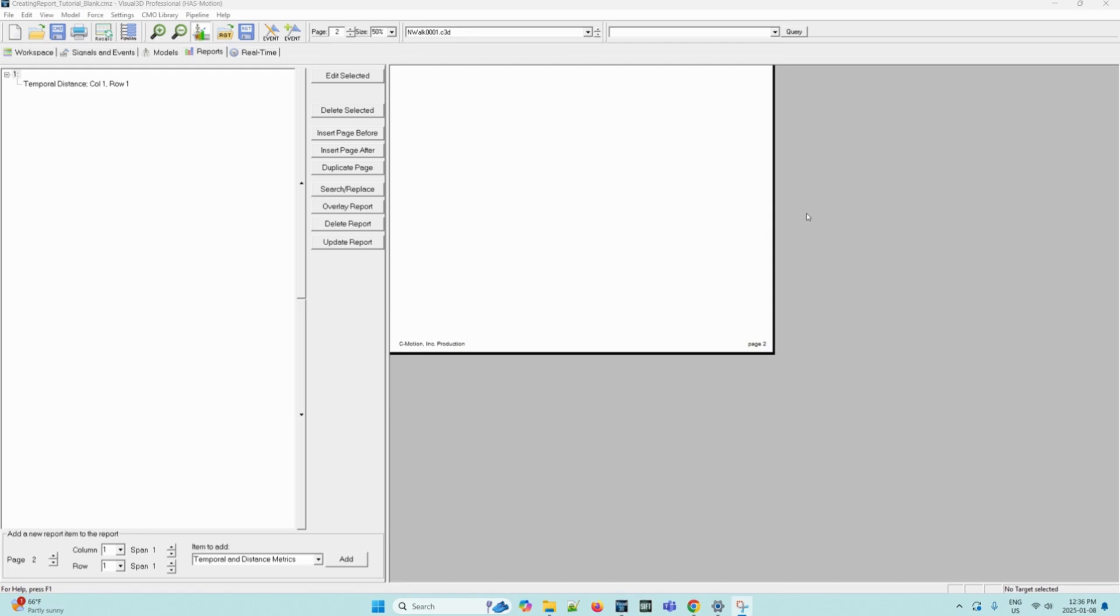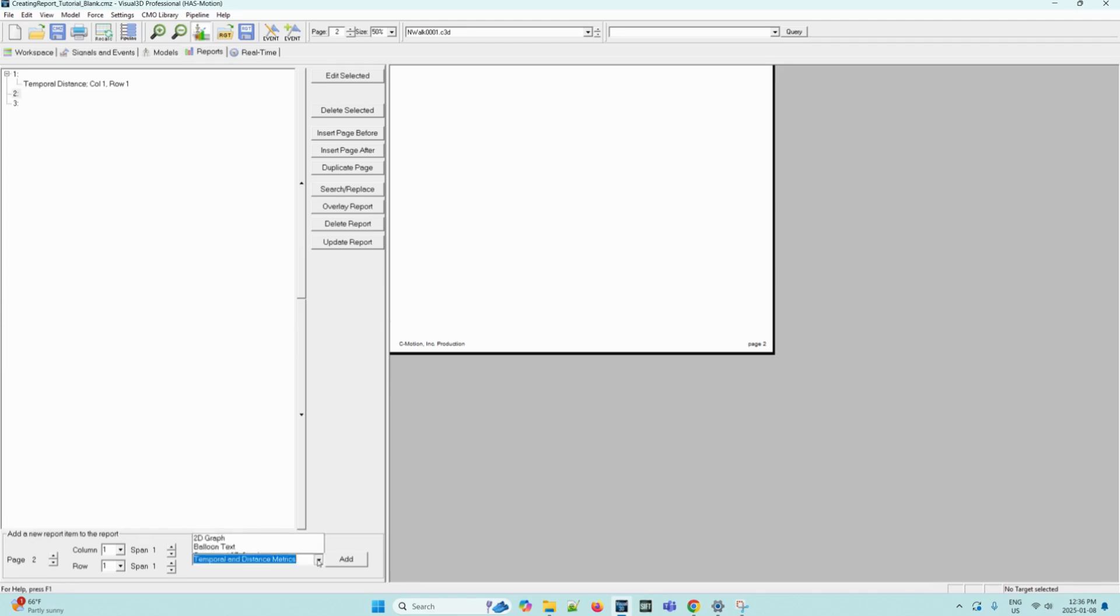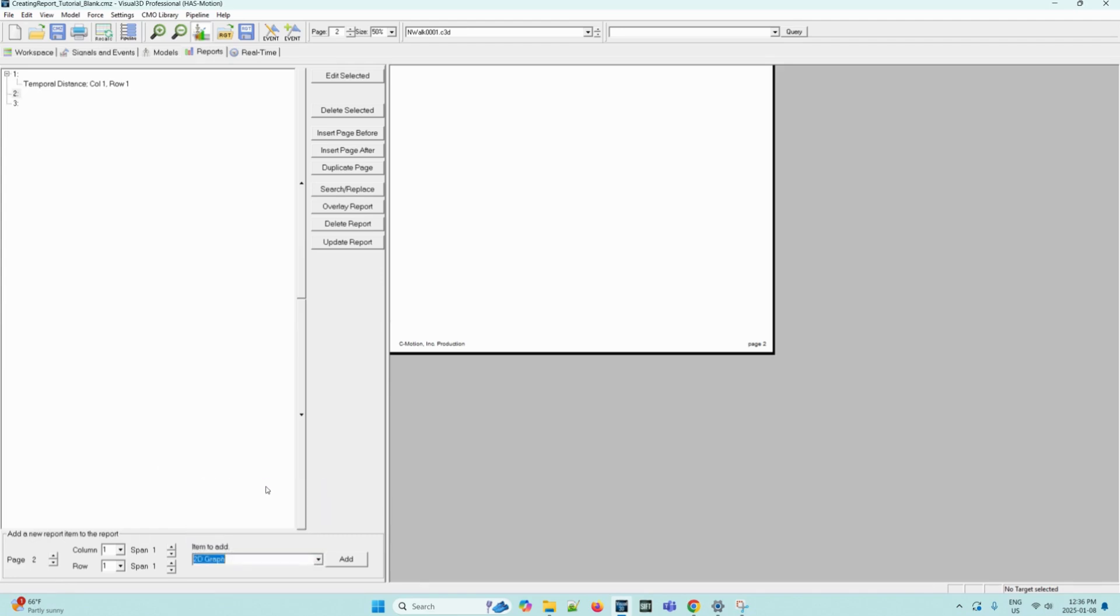Remaining on the reports tab, we can select the insert page after button. Now we can select number two and then in the item to add dropdown menu, we can click it and then select 2D graph and then click add.